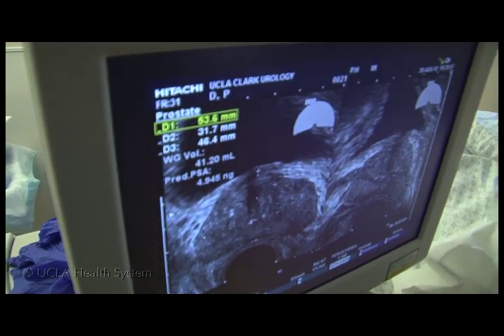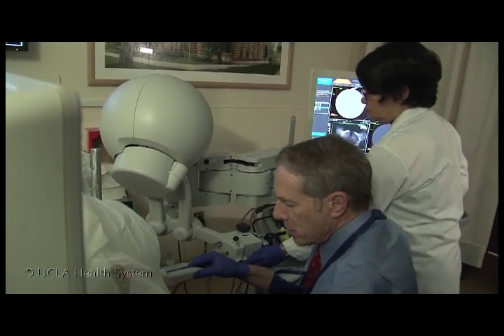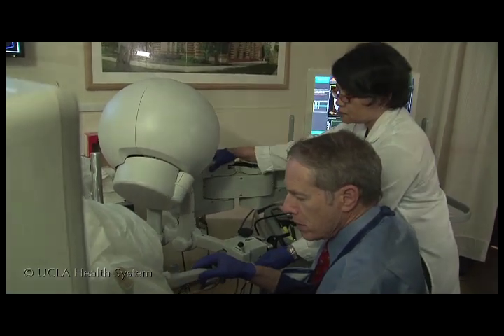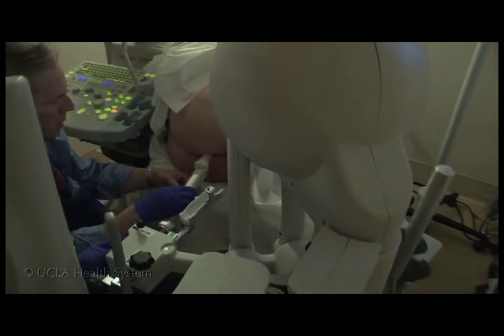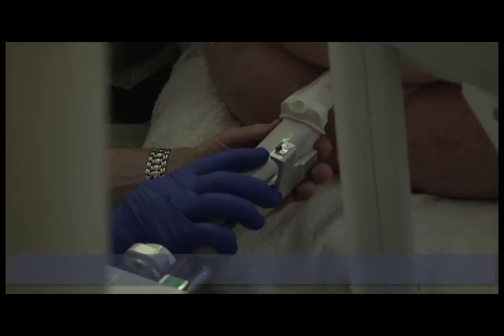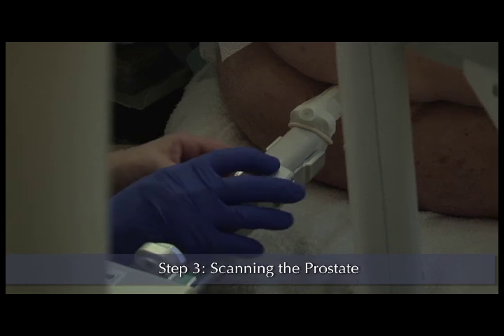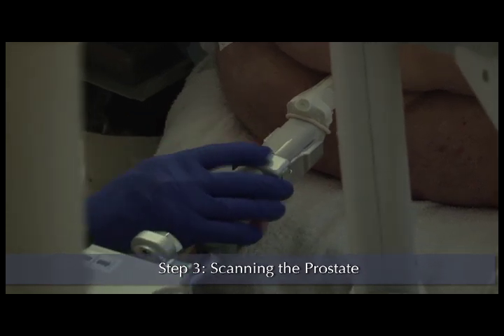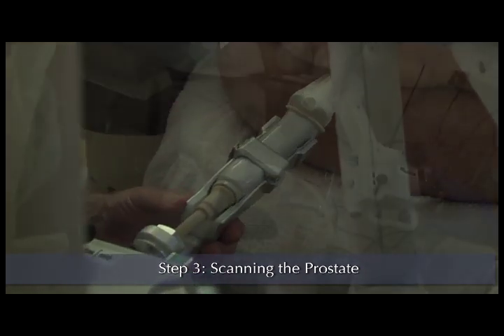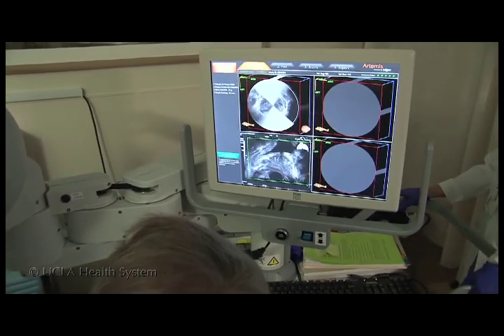The next step in this procedure is to bring the cradle of the Artemis device up into the ultrasound position. To bring the ultrasound probe into the cradle, we try to keep it as horizontal as possible, and a scan of the prostate is then performed by rotating the probe manually across approximately 200 degrees posterior surface of the prostate.